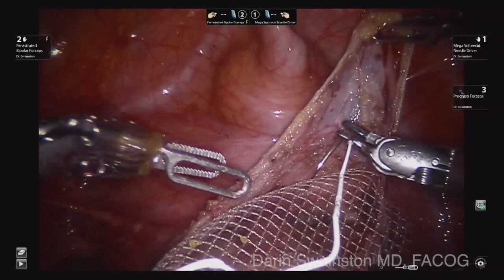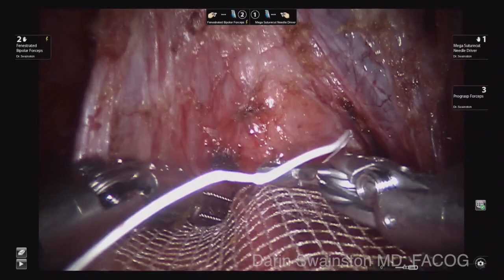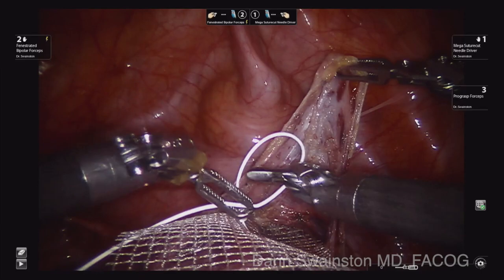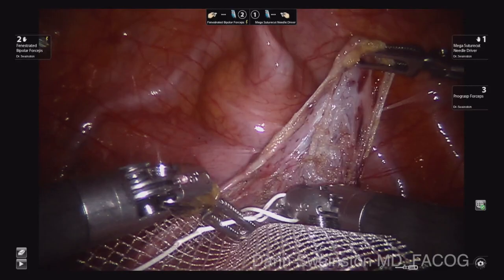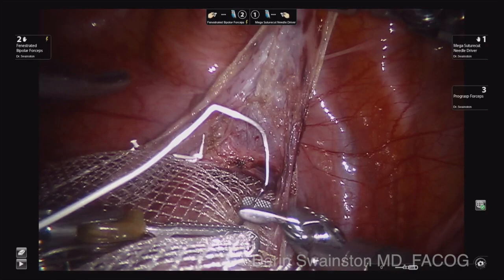I like using 2-0 Gore-Tex. We bring it in through the 8mm accessory port all the way down, and I am going to tie that right now. When I pull up, they grab that suture and pull it back out through there. They have to straighten the needle ever so slightly but I can keep reusing the suture over and over as a result. So I can tie this knot very quickly — I am going to cinch that down. A great thing about Gore-Tex is it allows you to really slide that knot down well. My assistant has the next suture ready for me — ready to go — and I can attach the next attachment point.